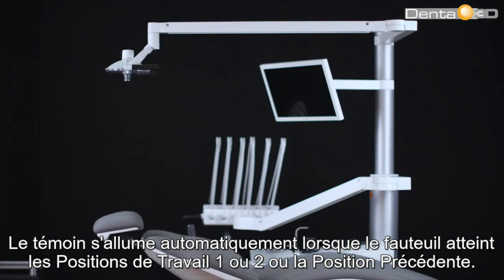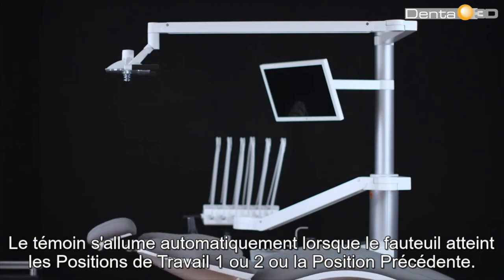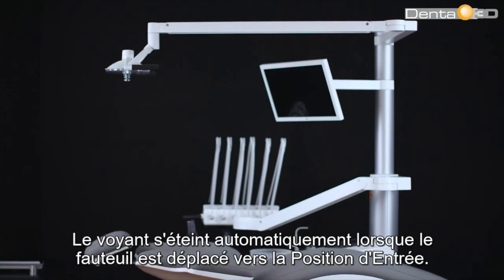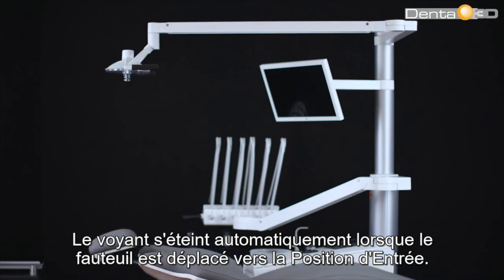The light switches on automatically when the patient chair reaches working position 1 or 2, or the previous position. The light switches off automatically when the patient chair is moved towards the entry position.